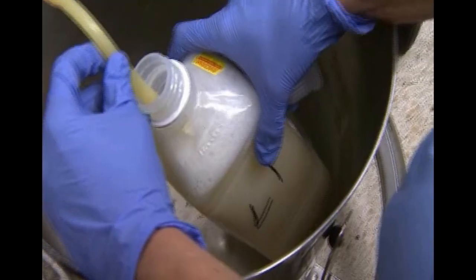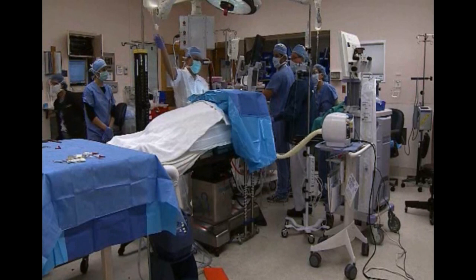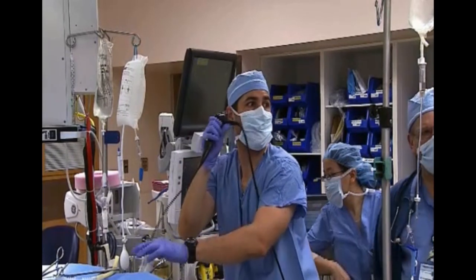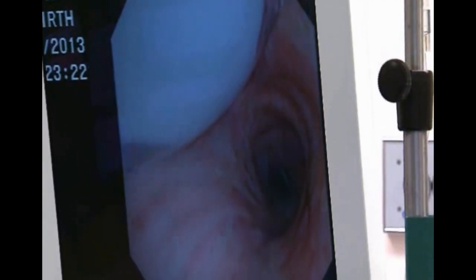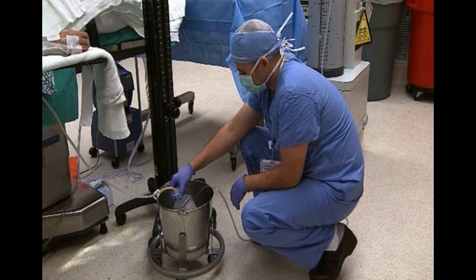Here we're showing how we collect samples of the lavage. This is a tube of the first sample — you can see the turbid appearance of the wash fluids. We do the same for the middle and end of the procedure to gauge the progress of the wash and how much protein we are able to remove by doing the lavage.